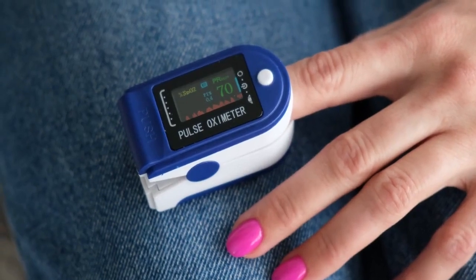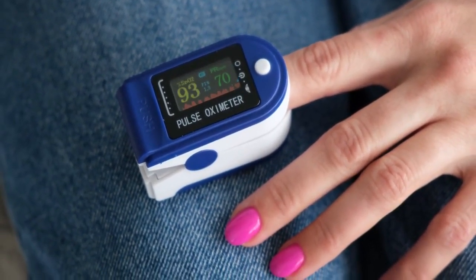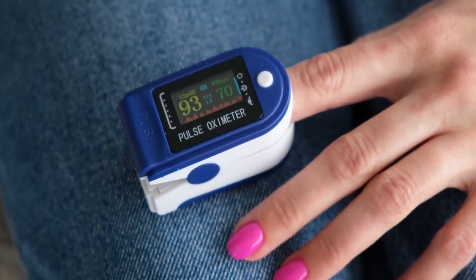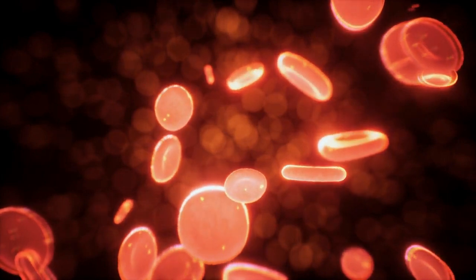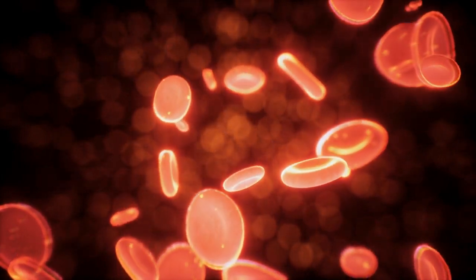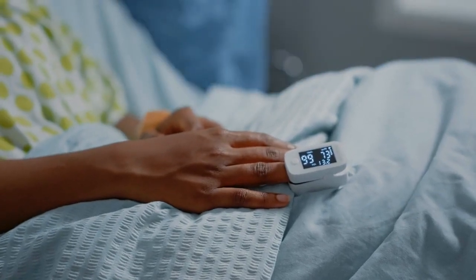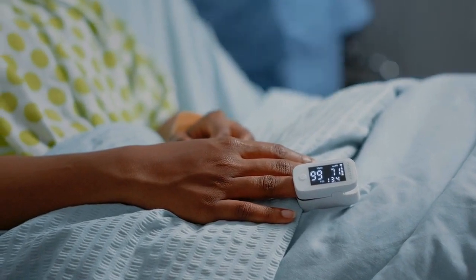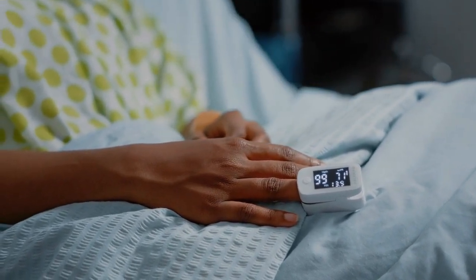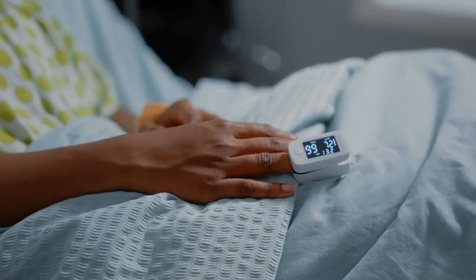An oximeter, also known as a pulse oximeter, is a medical device used to measure the oxygen saturation level in a person's blood. It's a non-invasive and simple tool that provides valuable information about the amount of oxygen being carried by the red blood cells. Oxygen saturation, often abbreviated as SpO2, is a critical parameter, especially for individuals with respiratory or cardiovascular conditions, as well as for monitoring during certain medical procedures.